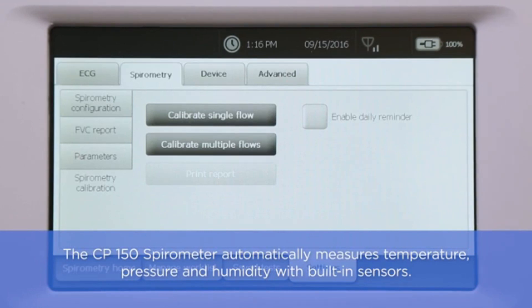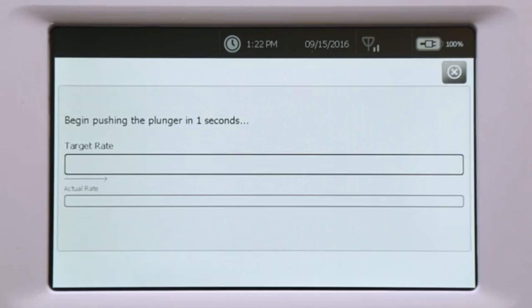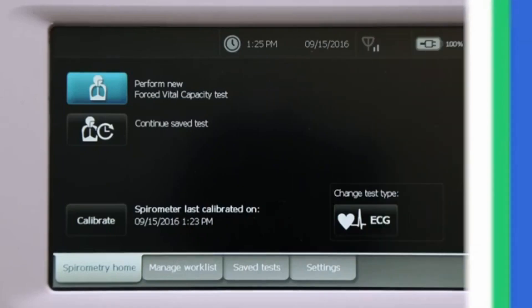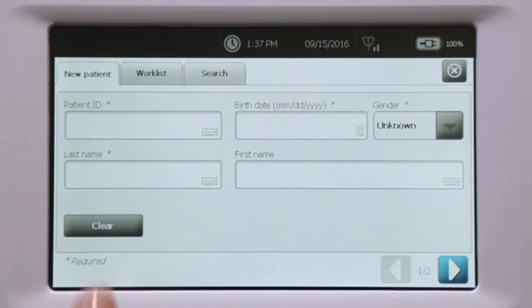Per ATS or ERS guidelines, the spirometer must be calibrated every day on which spirometry tests will be performed. Connect the flow tube to the three-liter calibration syringe. Touch the Calibrate button to initiate the calibration process and follow the on-screen prompts. You can manage the spirometer configuration, reporting parameters, and more on the Settings tab.